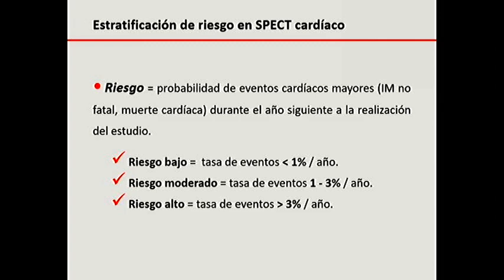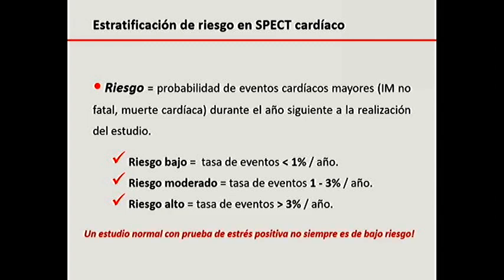So there is a discussion if we have to talk about risk, if we shouldn't talk about risk in our report. Okay? A doctor was saying the other day that the patient sometimes reads the report and he or she can interpret it in an alarming way. This could happen. He could be very concerned because of this, and maybe he won't see the cardiologist in 2 weeks' time. He will feel anguish. So we have to see how to handle information about risk. And this depends on the environment that we are in, to see how we can transfer this information.